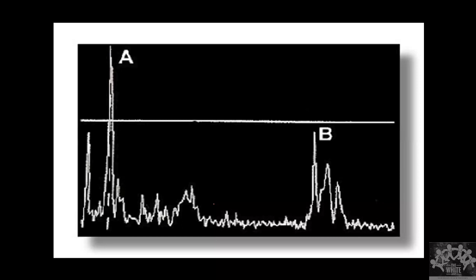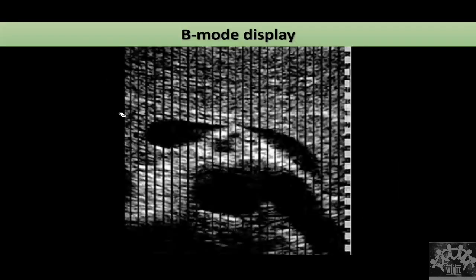We just see a few peaks. Okay, this is how an A mode ultrasound image looks. We'll see multiple peaks, and each one corresponds to different things. So that's how we get an A mode scan. I'll show you better images in the next classes. I just wanted to show how exactly the image is formed.